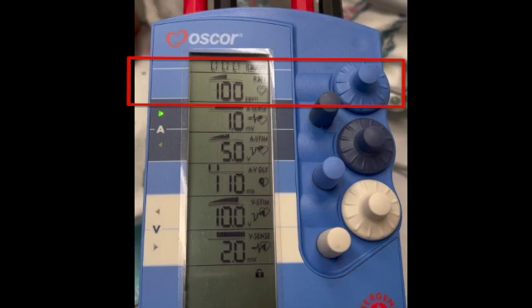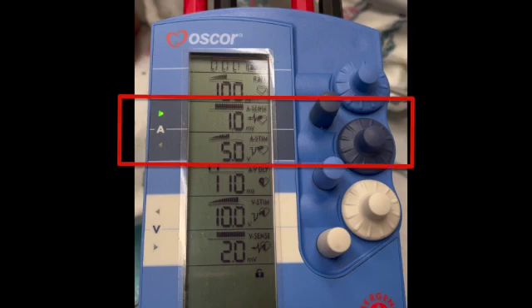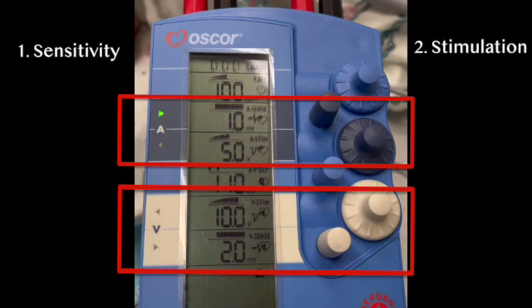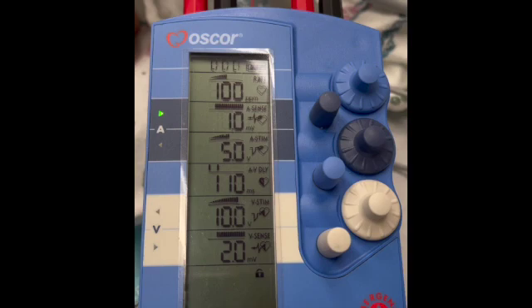Next up is the controls for the wires. Atrial on top, ventricular on the bottom. Both the atrial and ventricular wires have two things to set. The sense, which is how sensitive the pacemaker is seeing native heart activity, and the stimulation, which is how much energy the pacemaker is delivering when it paces. These will be covered in other videos.